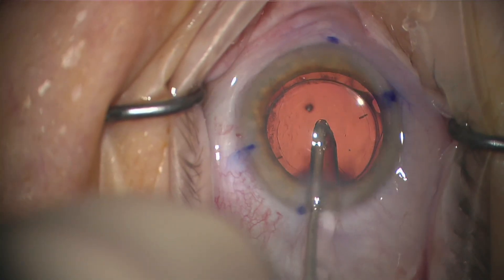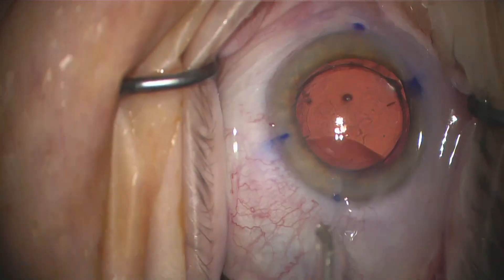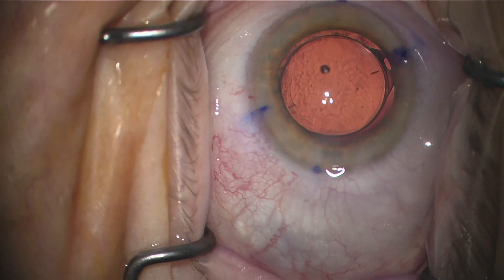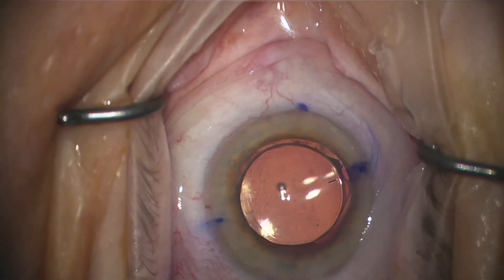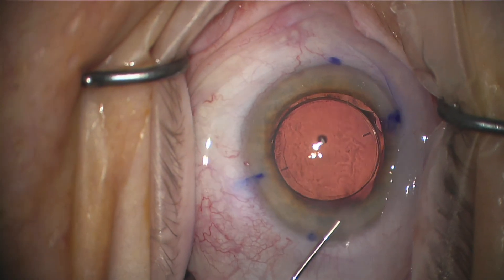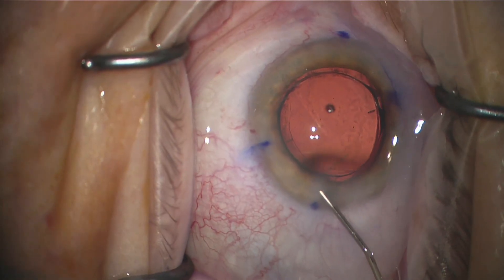Sometimes you need to back-rotate the lens, and the lens typically doesn't want to go that way if you have viscoelastic in there after it's already deployed. But if you have just fluid running and you use this technique, it'll go backwards — counterclockwise — and go directly into place. It's really quick and easy.